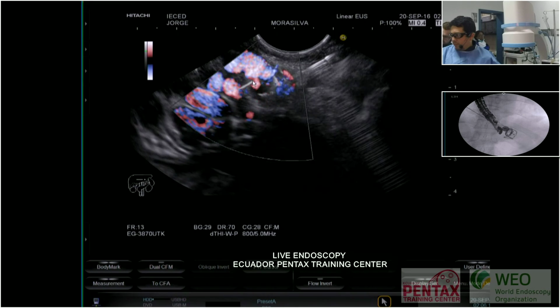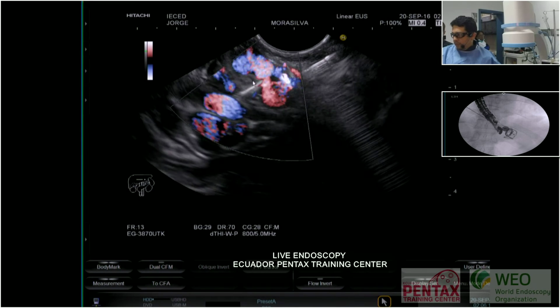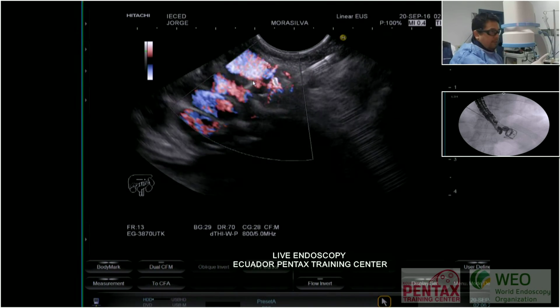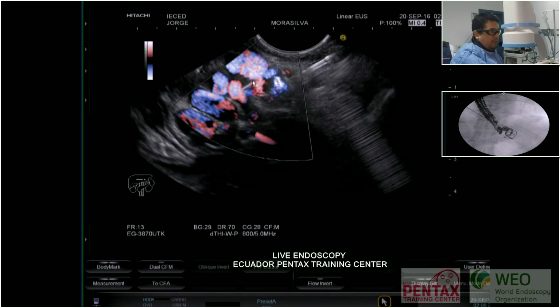So first I will flush my needle to avoid any clots inside or any rest of my guide wire. It's very good to do that, okay?